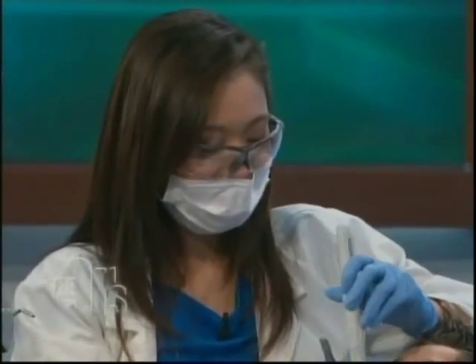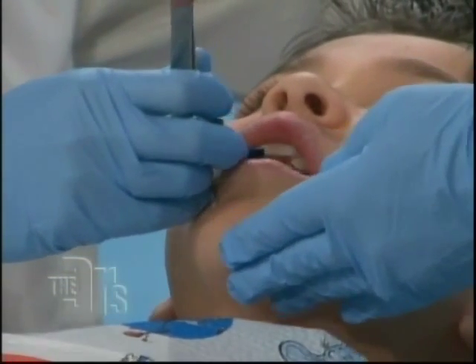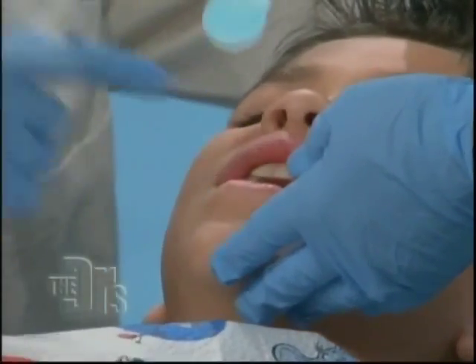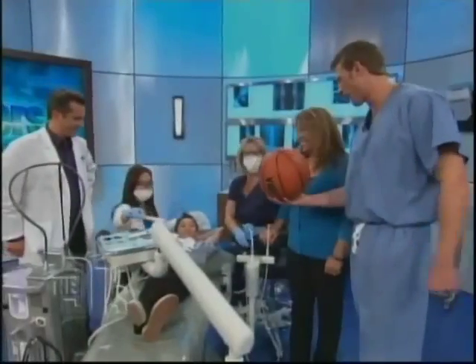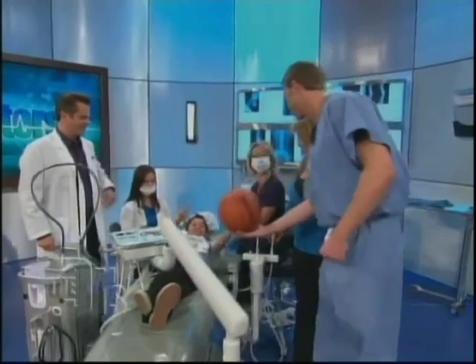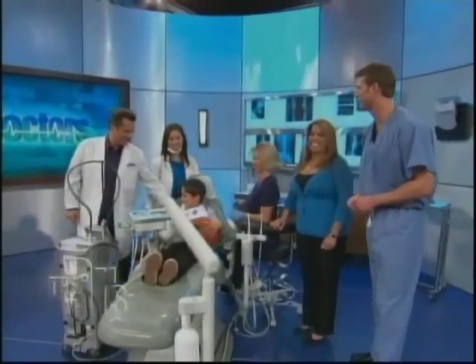We're going to have Zach bite on this blue paper — you see your dentist using this just to make sure they've built it up perfectly. Go ahead and chew for me, Zach, like you're chewing bubble gum. Zach, you feel good, right, buddy? How does the bite feel? Good. Zach, you've been such a good sport. Here's your own basketball signed by all the docs — so you can beat me blindfolded. Thank you so much.